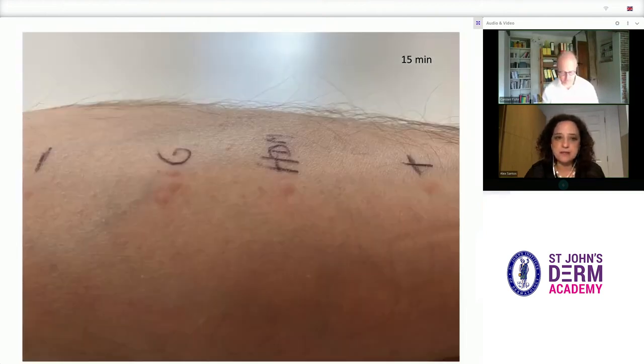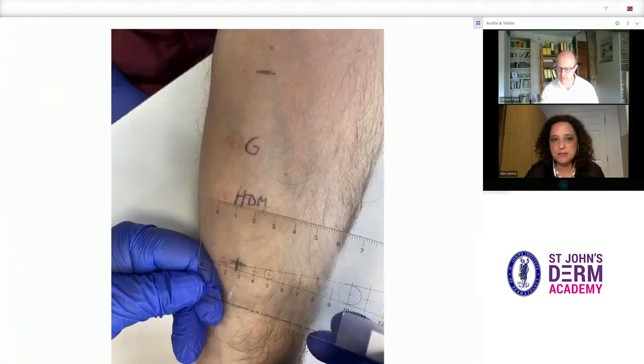Seen here more closely, you can clearly distinguish the raised wheals at the test sites. The wheals need to be measured and the measurements recorded. It is useful to have a transparent ruler for this purpose, but it's not essential. The histamine wheal, as you can see here, is around five millimetres in diameter.